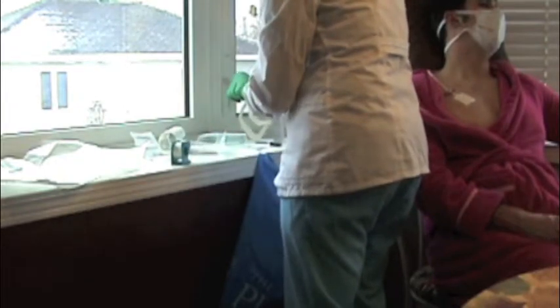And then on a piece of tape, I'm going to write the date right here on my Tegaderm sheet. It is the 5th day, the 10th month, and the 12th year, and I did this at 1200, and I'm going to initial it. And I'm going to apply that to the Tegaderm strip. I don't want to write on my patient, it's actually very rude.